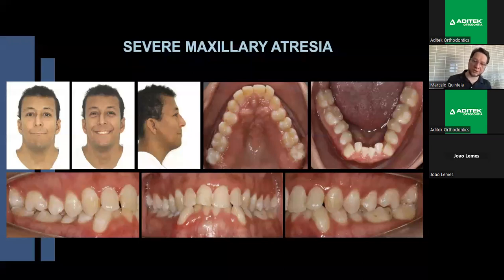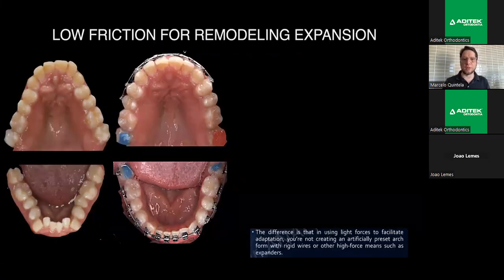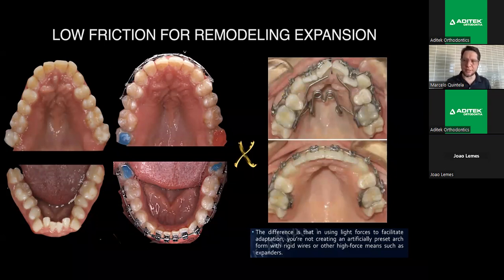All patients here are treated by myself or by other teachers in our school or by our students. And this is another one that has a very severe maxillary atresia. And look what was obtained with low friction for remodeling expansion and archwires that are expanded. So it's different to do that. And the difference is that in using light force to facilitate the adaptation, you are not creating an artificially preset arch form, as used to occur with rigid wires or other high-force means such as expanders.